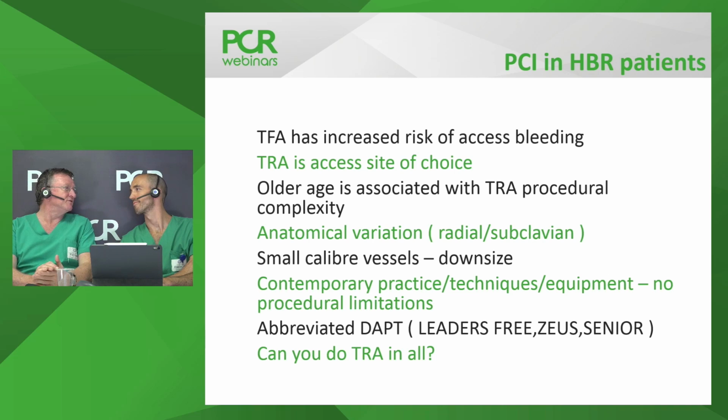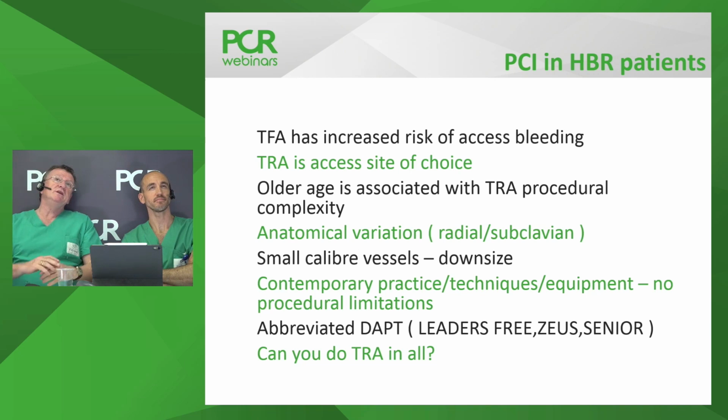Thinking about angioplasty in patients who are at increased bleeding risk, femoral access has an increased risk profile in these patients. For sure. I think there's no doubt, based on extensive randomized and observational data, that radial access is the site of choice. One thing to bear in mind, and I think we've seen that today, is that older age is associated with radial access procedural complexity, particularly the incidence of anatomical variation in the radial artery rises with age, and the incidence of subclavian tortuosity rises with age.